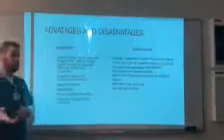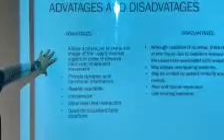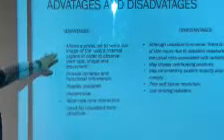There are advantages and disadvantages to fluoroscopy. The advantages are that they allow the physician to see a live image of the body's internal organs and to observe their size, shapes, and movements. It provides dynamic and functional information. They're readily available, it's not that expensive, and it allows real-time interaction. And it shows good visualized bony structures for when they look for bones or anything like that.